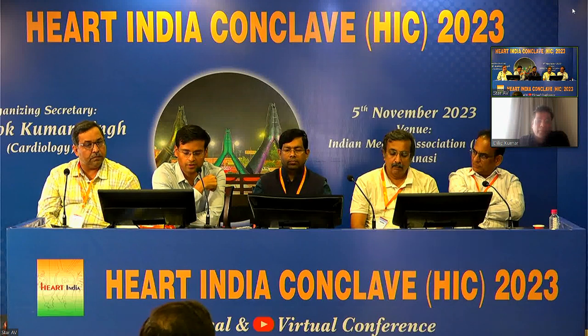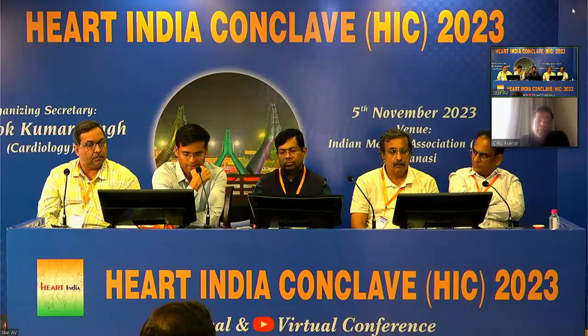How much percentage reduction is seen in the systolic volume and end-diastolic volume? Most of the studies have shown 11 to 15% reduction. Some of these cases have shown more, some less, with a mean of 14 to 15% LV systolic volume reduction. Okay, thank you.